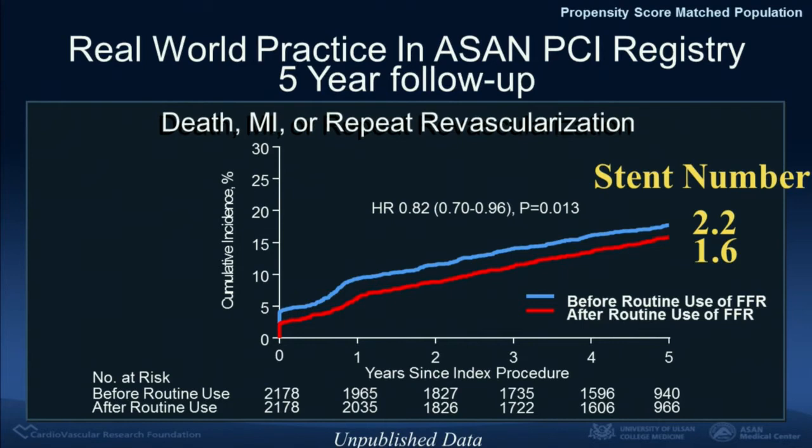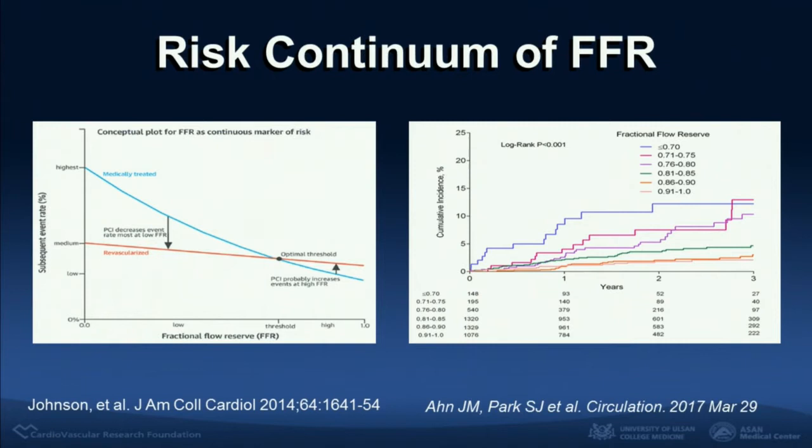In addition, the FFR value itself has prognostic value. This is a risk continuum. So lower FFR value, higher risk. The same finding was reproduced in our registry data. According to the FFR, high FFR, low FFR, there is a gradient of risk.